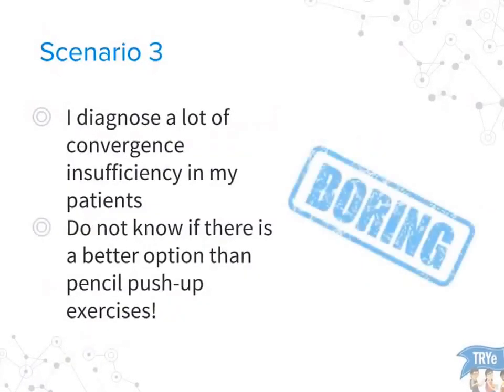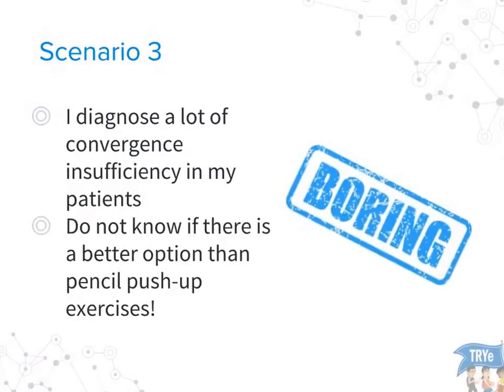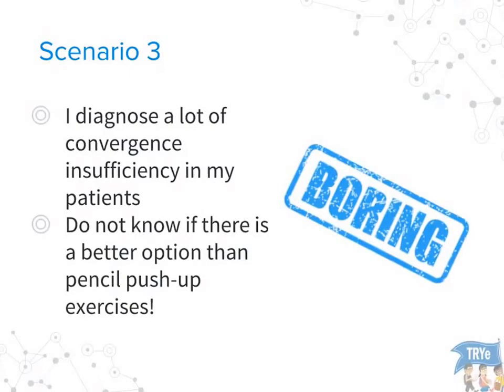You could be diagnosing a lot of convergence insufficiency in your practice, but you do not know if there is a better option than pencil push-up exercises. And as all of us know, these exercises have become very boring.